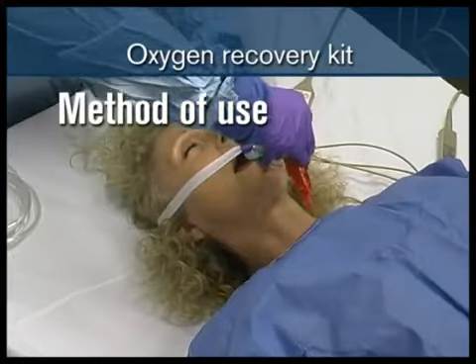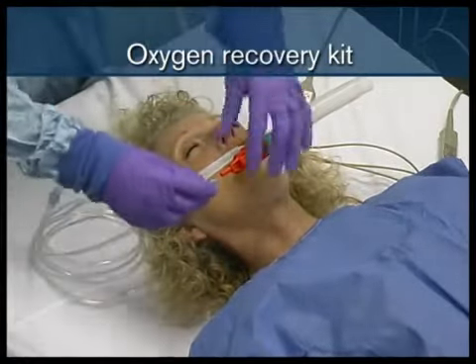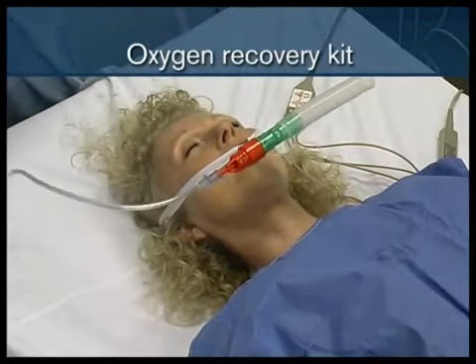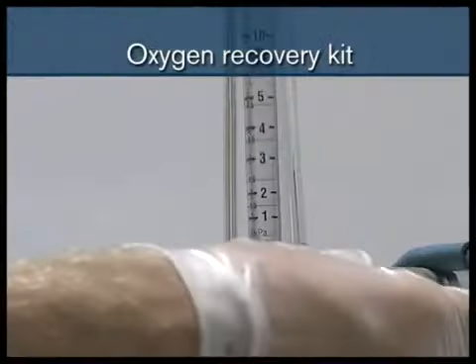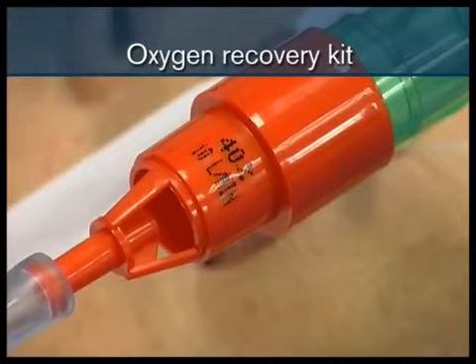Connect the T-piece to the 15mm connector of the tracheal tube or laryngeal mask airway. Attach one end of the oxygen tubing to the valve spigot and the other to the oxygen flow meter. Set the flow meter to the flow indicated on the valve.